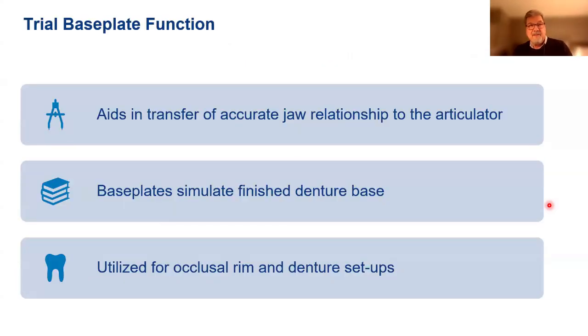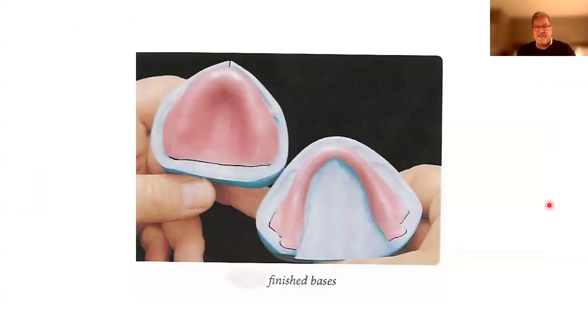So what's the function? For a base plate, it aids in the transfer of an accurate jaw relationship to the articulator. Base plates simulate finished denture bases. It's utilized for occlusal rims and denture setups. And there are your finished denture bases here.